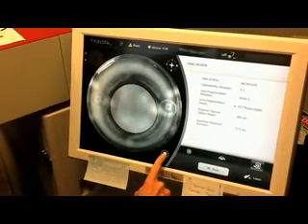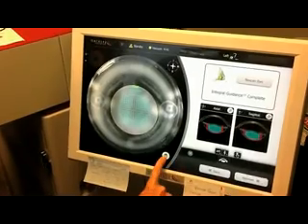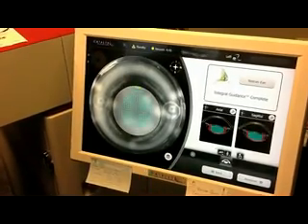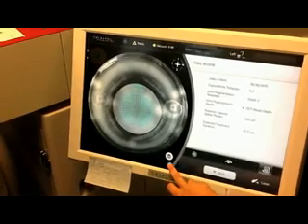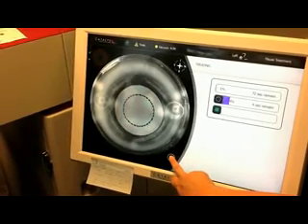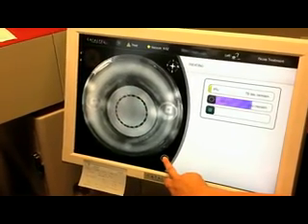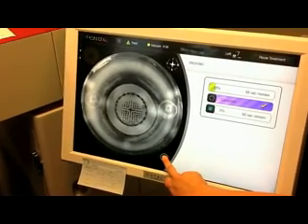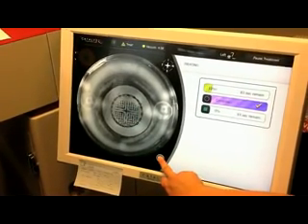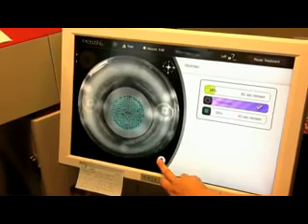Now, how is this different from a traditional cataract surgery? Well, as I said, everything has to be done manually, and although you can have great dexterity in that after thousands and thousands of operations, this is more akin to an autopilot. If you fly commercially, you have skilled pilots in both seats, but the autopilot does it a little better. And although I try to emulate and be as good as this machine, I can't quite do it.